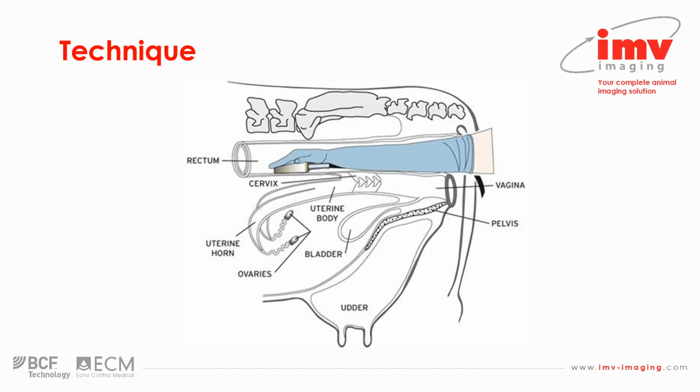Once we've done that and we've got our arm in, usually to around about the elbow or just before, depending on the size of the technician or veterinarian, we can then cup the probe in our hand as shown in this picture, usually gently pinching the probe between the thumb and either third or fourth finger, depending on your preference, with your second or middle finger, so index or middle finger, sitting on top of the probe. In most cases there will be a ridge or a concavity in the top of the probe that just gives you an indication of which way up the probe is and whether you have it in the correct orientation.